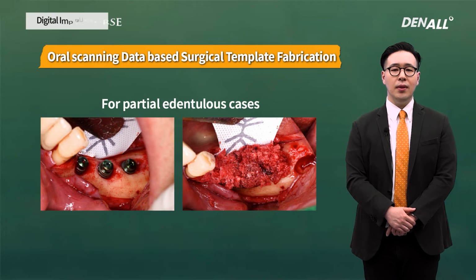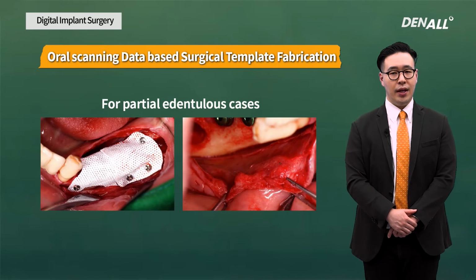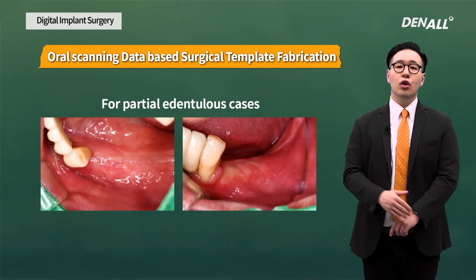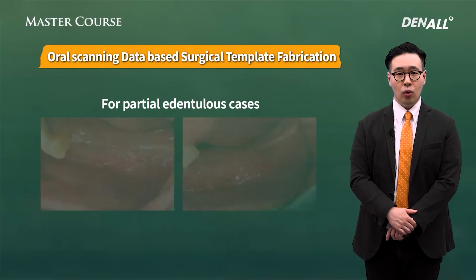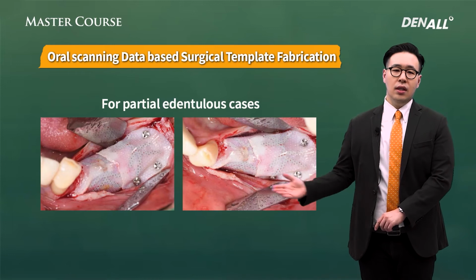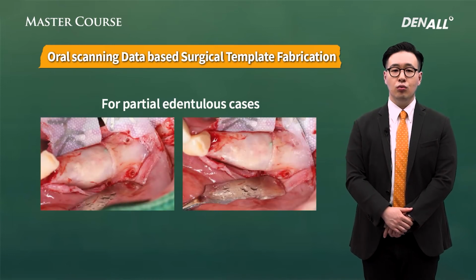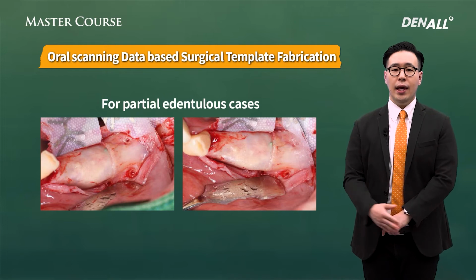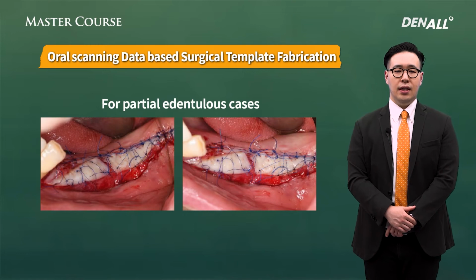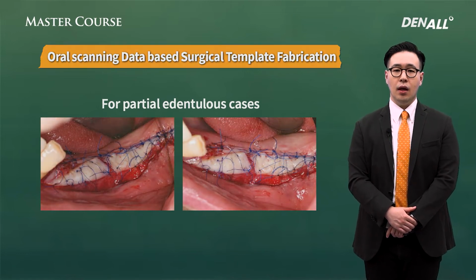Autogenous bone is combined in the graft material, and the titanium-reinforced DPTFE membrane is fixed. The flap is released, and primary suture is done. After 6 months, it looks like this. After the flap is raised, the titanium DPTFE membrane is exposed and removed, and you can see thickly ossified regenerated bone, which is verified before performing FGG. The second surgery is also planned.